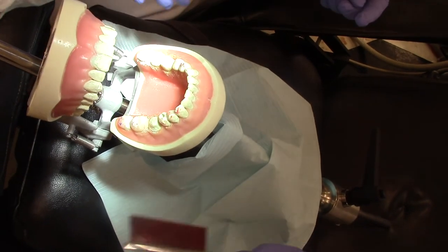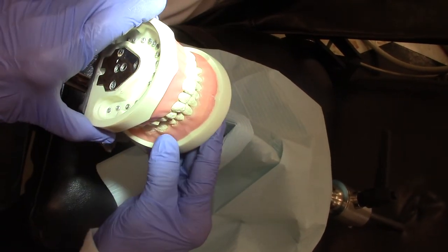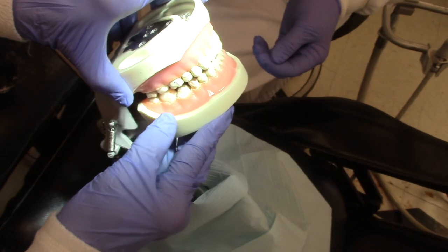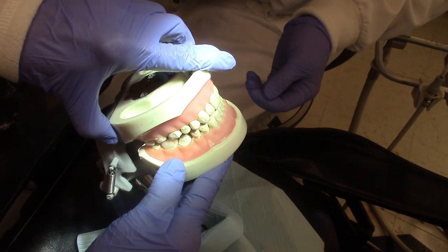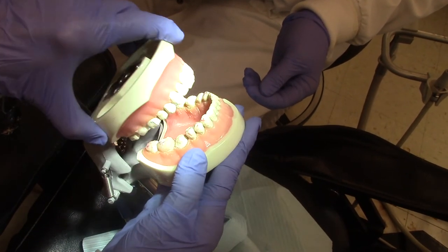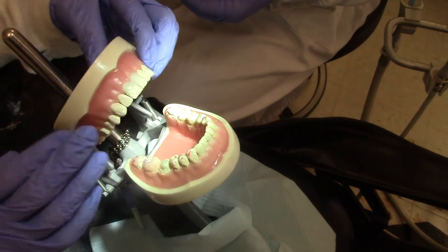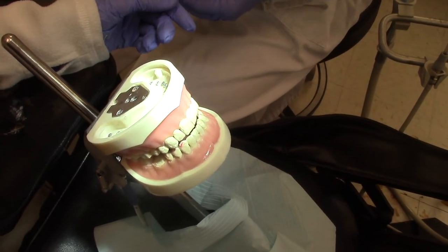What we would do is take our high-speed handpiece and adjust it. The root canal tooth always has to be adjusted at least a millimeter shorter because every time the patient bit down or slid their teeth together they would be hitting on that corner, which has a bruise-like effect. We would take tooth number 31 out of occlusion altogether so they weren't biting on it — remember, we're going to put on a crown anyway. Then we would give our post-op instructions to the patient after the bite adjustment and send them on their way with their next appointment in two to three weeks. And that's how you do a root canal procedure.